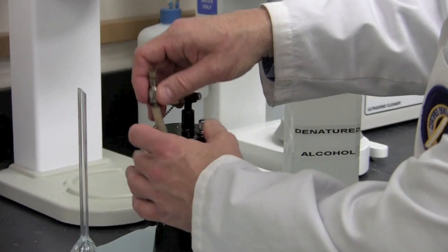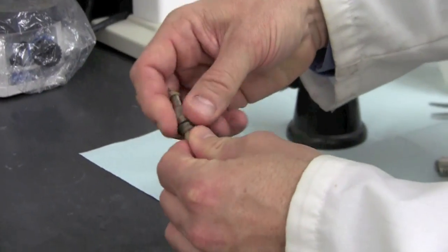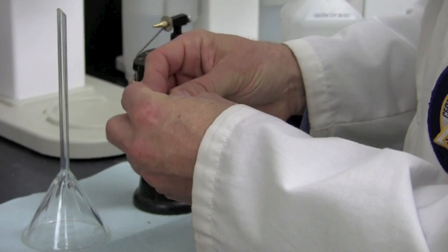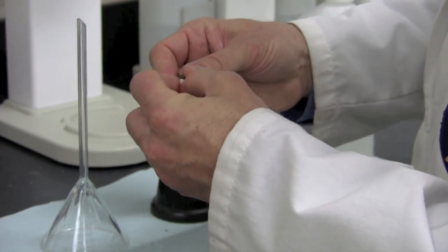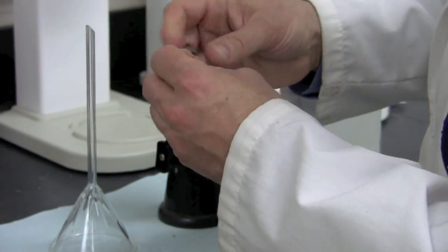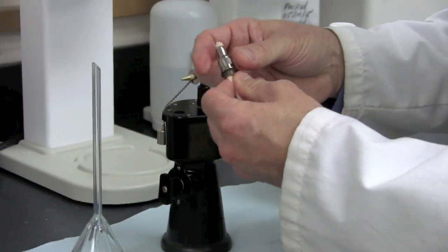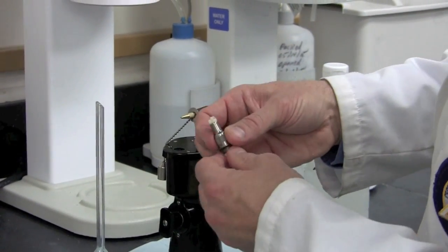If it's necessary to replace the wick, remove the old wick and unscrew the wick out of the wick holder. Take the new wick, feed it into the bottom of the wick holder, and turn until the fresh wick emerges through the top. We want to leave enough to allow for space between the nozzle and the wick holder.